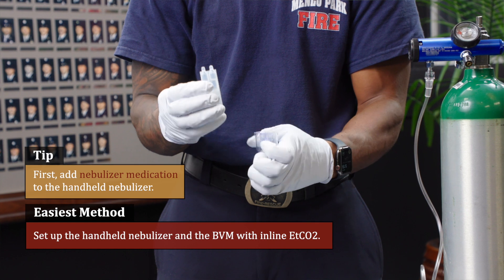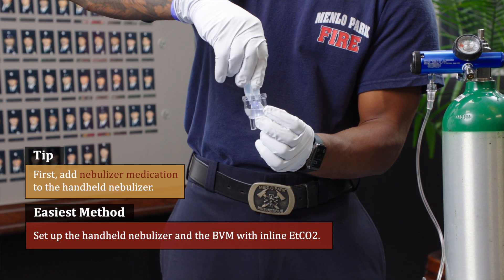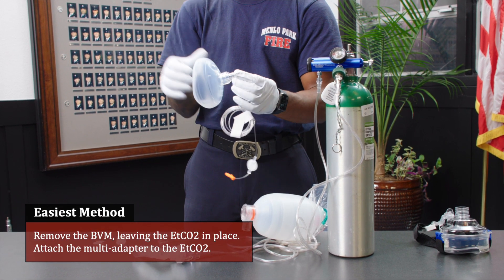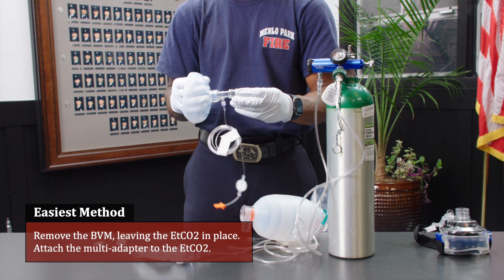The easiest method is to set up the handheld nebulizer and the BVM with inline end tidal CO2. Next, remove the BVM leaving the end tidal CO2 in place. Attach the multi adapter to the end tidal CO2.